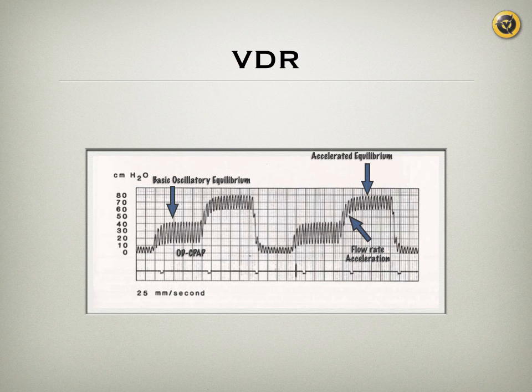And what is the importance of this mode? The importance of this mode is that oscillation is very helpful in loosening secretions and breaking down bronchial debris, and that happens in inhalational injury. Patients who are burned with inhalational injury will benefit from that significantly. Also, because you are oscillating and it doesn't have to be a closed system, the patient can tolerate higher pressures, so you can see here on that graph the convective rise can yield a pressure of 80 centimeters of water.